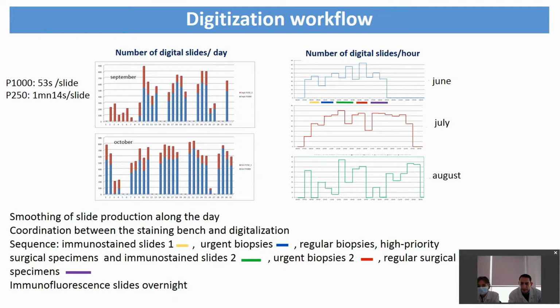In the end, the time required to obtain the digitization of a specimen varies from less than 10 minutes for biopsies to nearly 6 hours for certain surgical specimens, depending on the order of digitization and the number of slides.